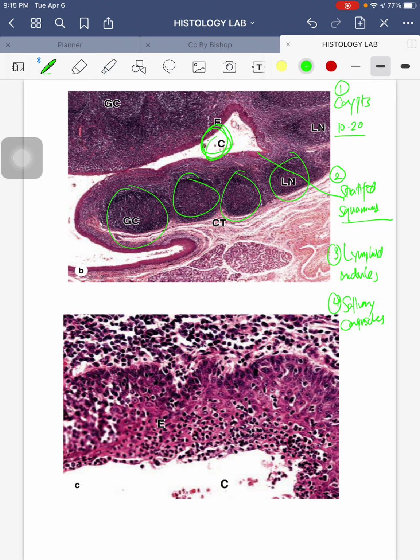Take note that in this slide, there are many dot-like structures, already your lymphoid cells. This can be T cells or B cells here. And this is still within your squamous area, the lining epithelium. But now, if you notice, it's already infiltrated with lymphatic cells.